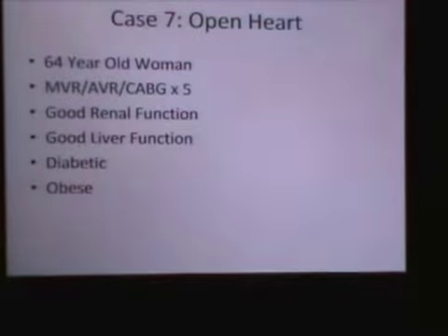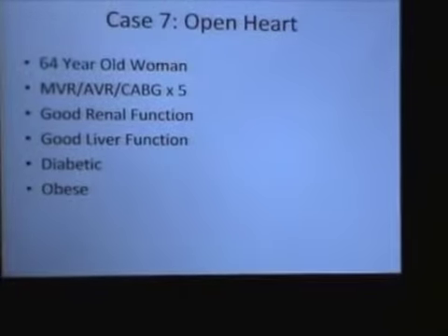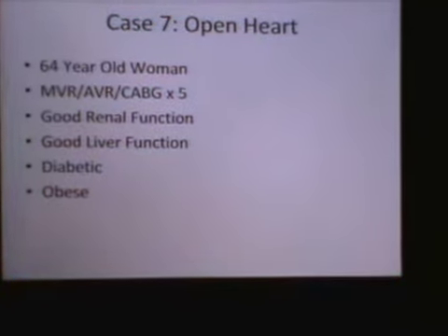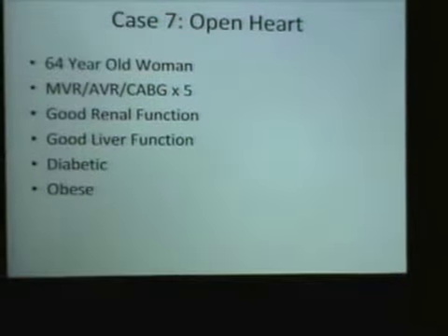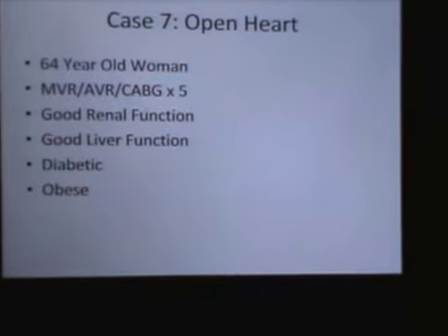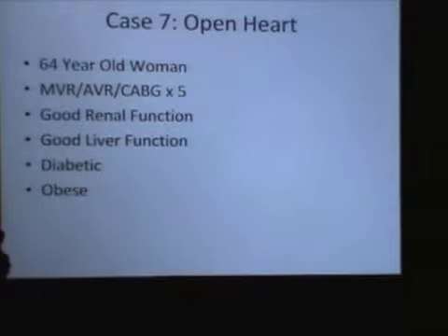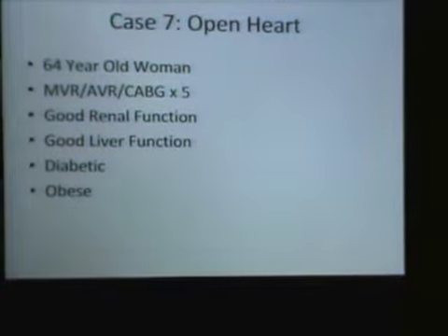So we order it if the patient is on Plavix or aspirin, and if they're not on platelet inhibitors, order one anyway. Make sure they're going to be okay for surgery, especially the older patients. They could be on these quote-unquote nutraceuticals, omega-3s, fish oils. You just don't know. And they do affect the platelets.